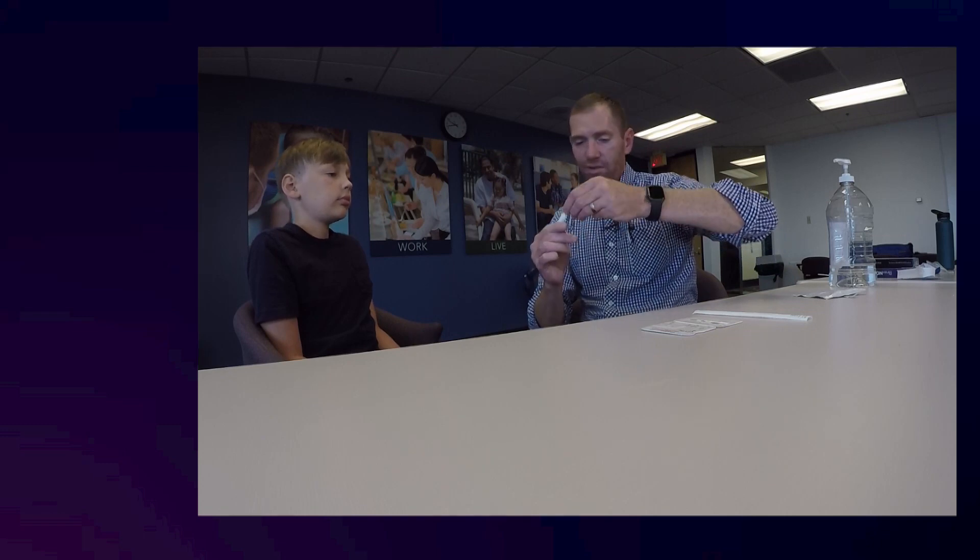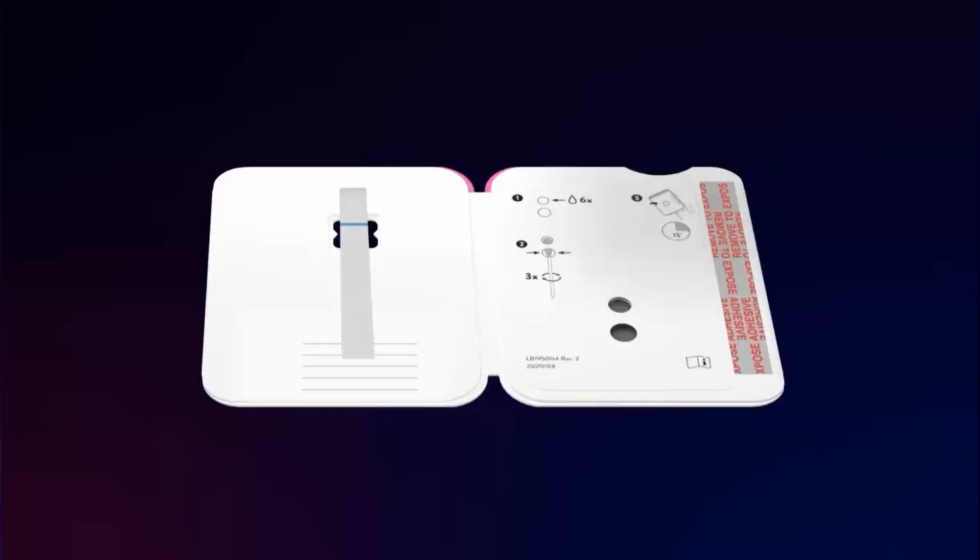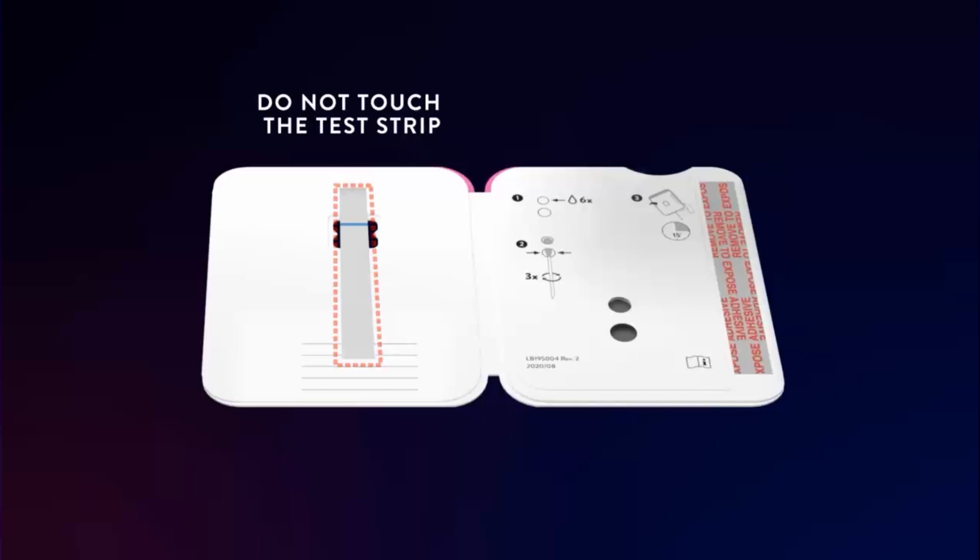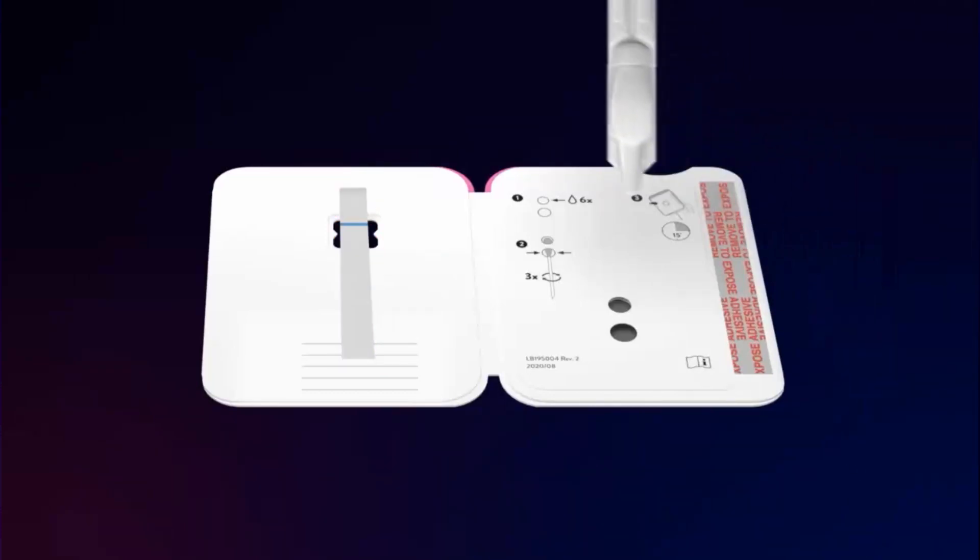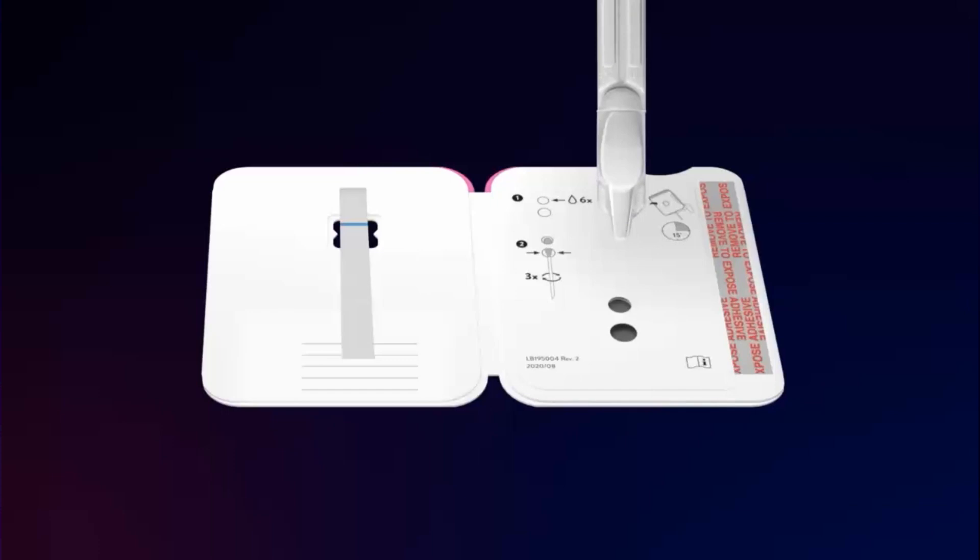This is the developing solution, so we're just going to twist the cap off. There are two holes here on the card. We're going to put six drops of solution into the top hole, and once you've put the solution in the top hole, the test is ready to go.